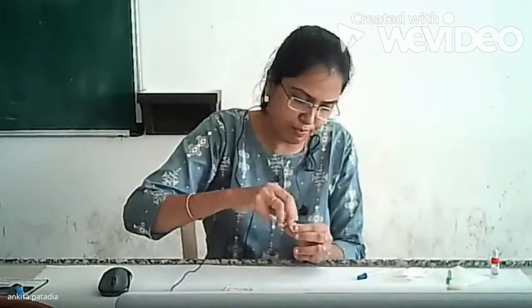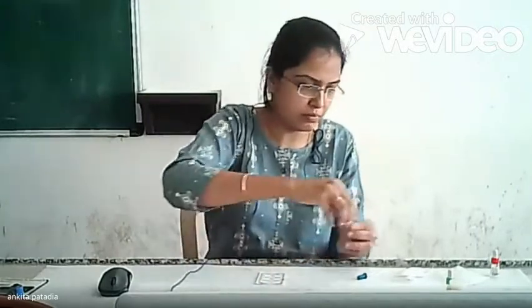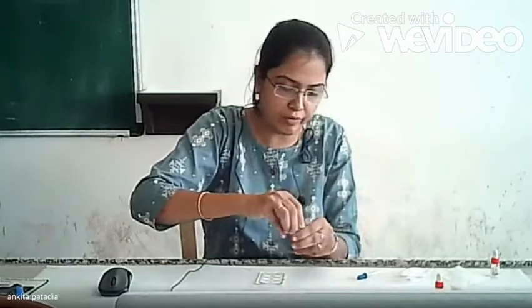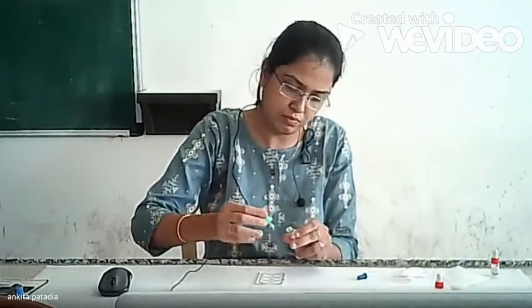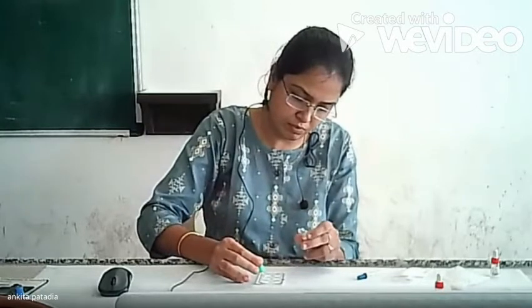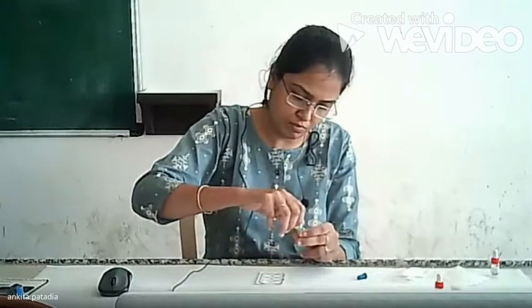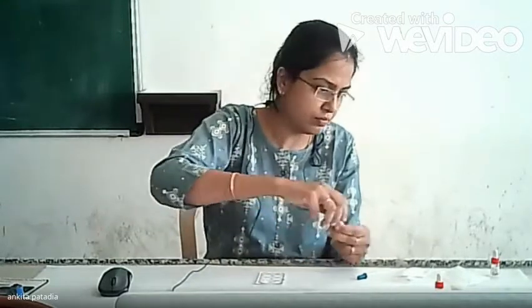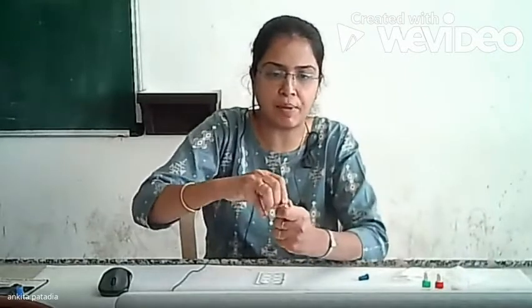One drop. Then negative control. And we are having this test serum sample over here.